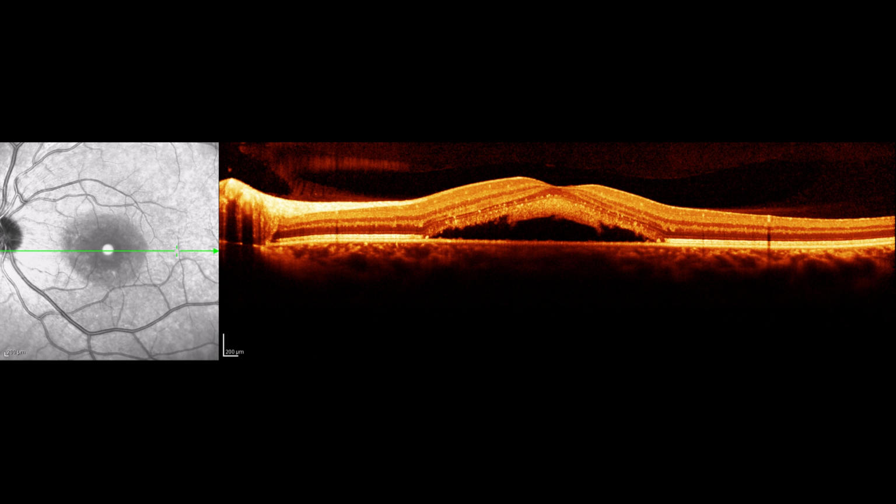I think they're all outer segments that are just still hanging on to the bottom of the photoreceptors that have been shed. It didn't look like fibrin on exam, but you do see fibrin sometimes in chronic retinal fluid. If you saw this, that shaggy look, in a patient, let's say mid to late 50s or early 60s, no drusen, would you think about something else, or would you just call it CSR?